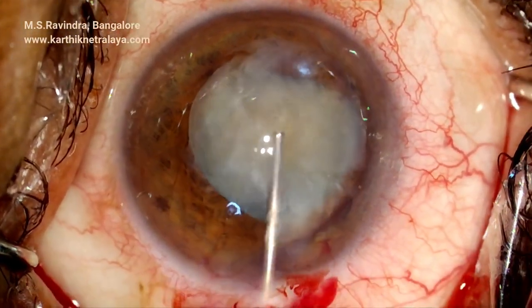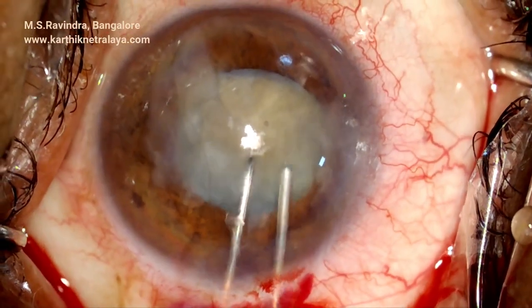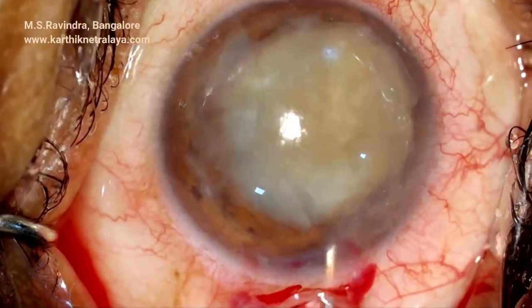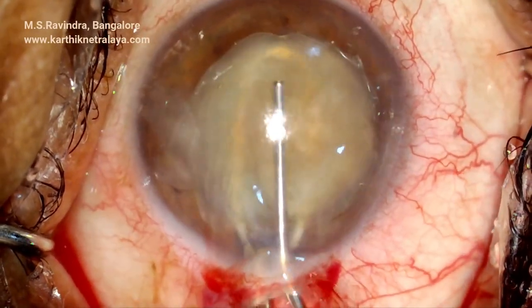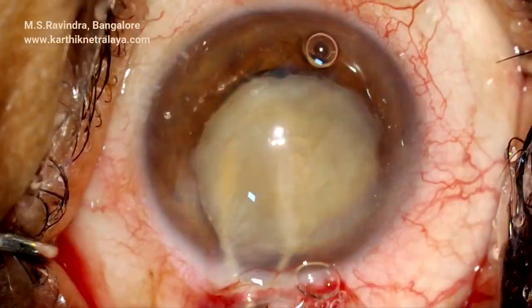It is not a very large nucleus. The size of the rhexis should be adequate to allow nuclear prolapse. If the nucleus is large, you need to do a larger CCC or give a relaxing cut. It is tried to be bisected with the shaft of a 25 gauge cannula.